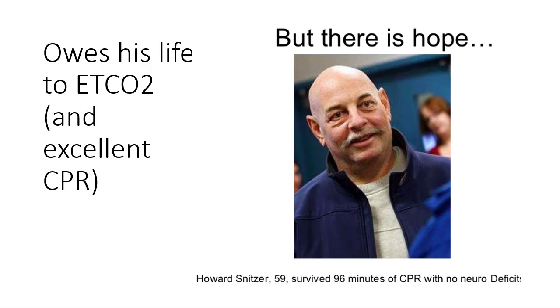He's in VFib. They shock him a total of 11 times. They keep working it. They're now at an hour and 30 minutes. 11 shocks. He's still got good end-tidal CO2. The only reason they didn't call it was because of his end-tidal CO2, and then he resuscitates. They get ROSC back. They convert him. And guess what? After 96 minutes of CPR, 3 or 4 days later, whatever it was, he walks out of the hospital with no neurological deficits because of high-quality CPR, which was the reason why he survived, and because of end-tidal CO2, which is the reason why they gave him a chance to survive.